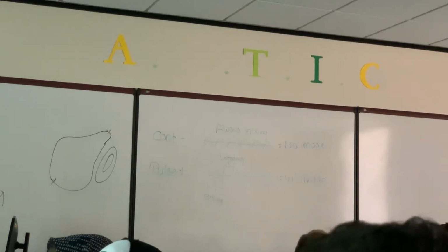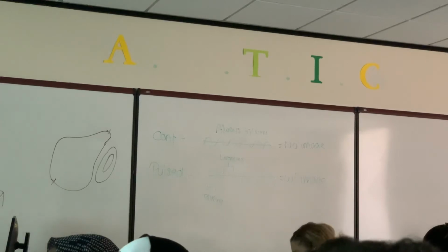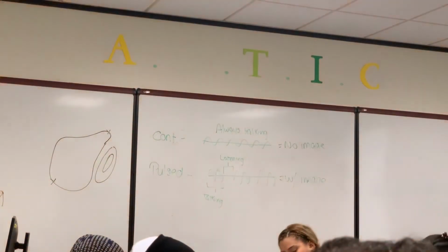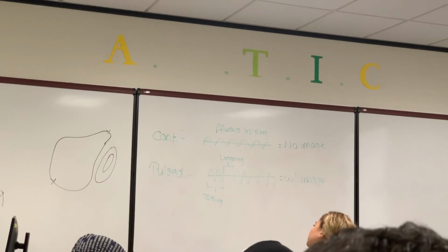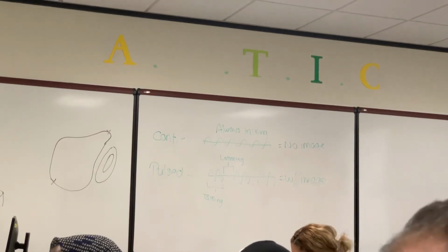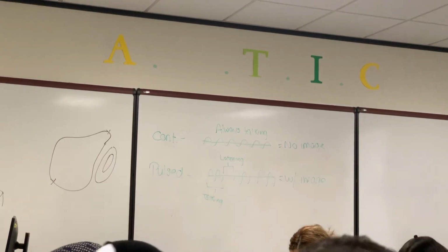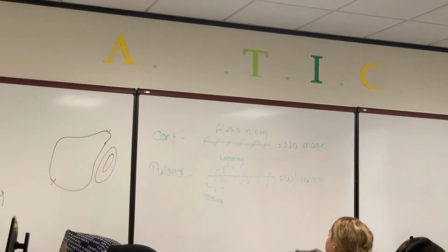So pulse duration, when we're talking about pulse ultrasound, is the actual time from the start of the pulse to the end of the pulse. That time where it's talking, that's the pulse duration right there. Just my talking time. Whatever we measure that time as, that's going to be the pulse duration, how long.